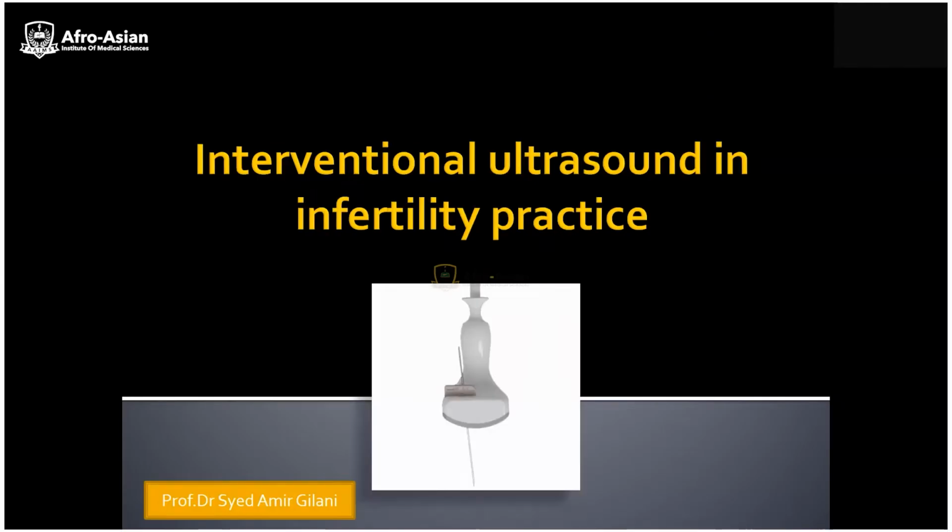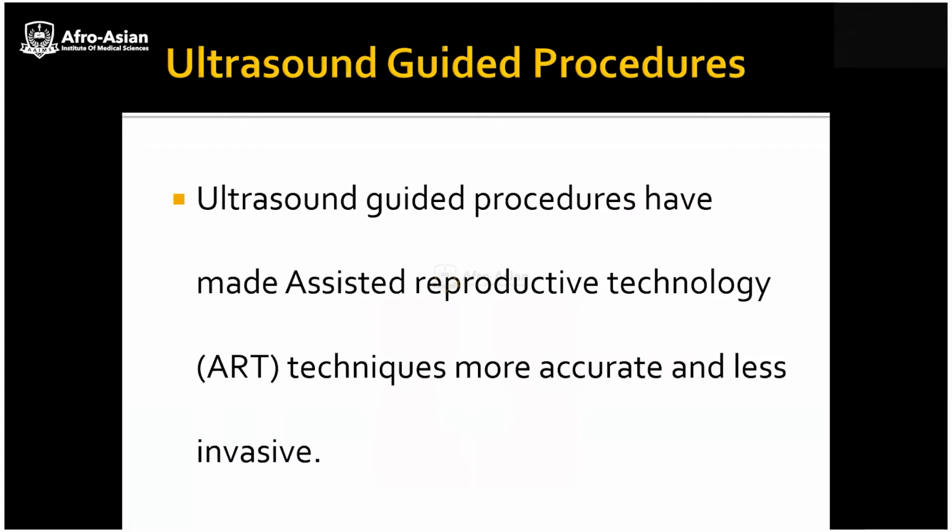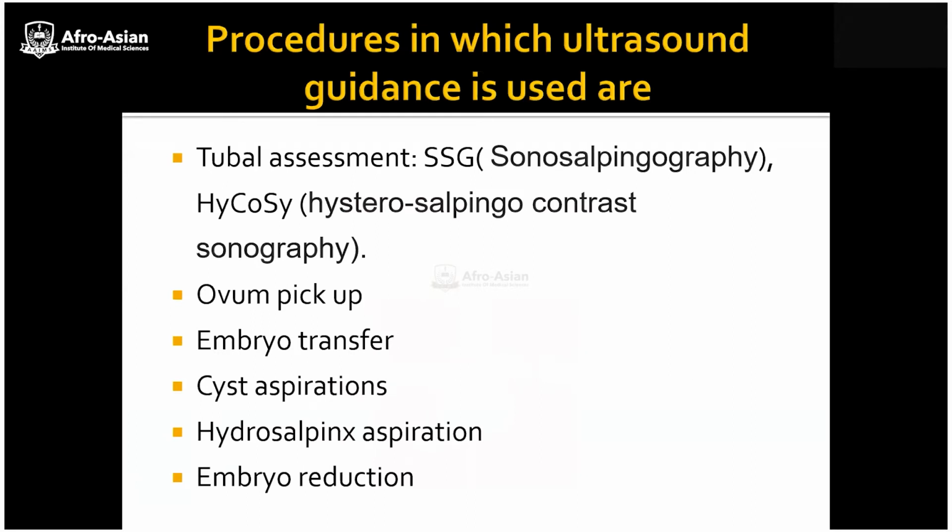Interventional ultrasound in infertility practice. So let's start. The ultrasound guided procedures have made assisted reproductive technology, which is ART, techniques more accurate and less invasive. Procedures in which ultrasound guidance is used are tubal assessment.